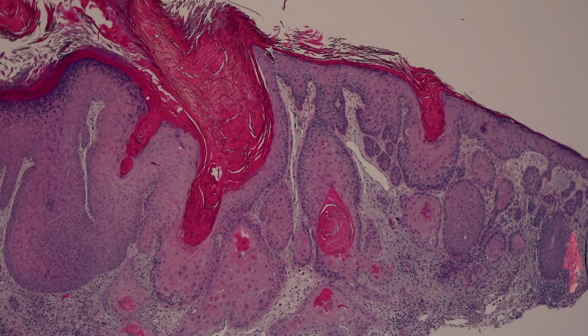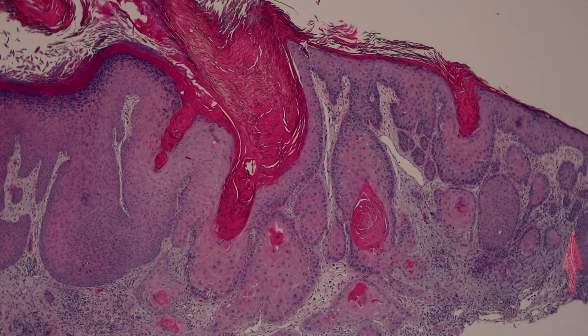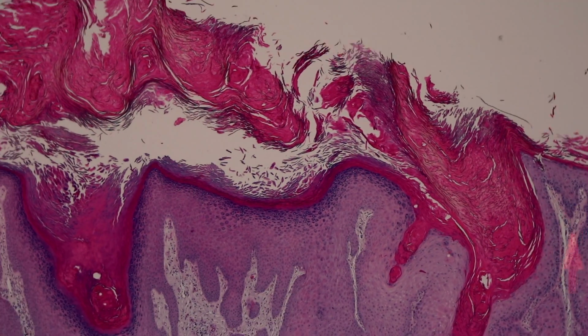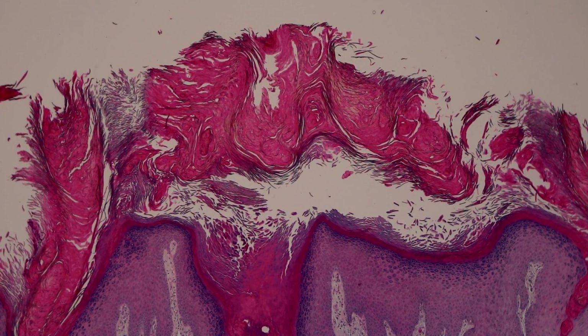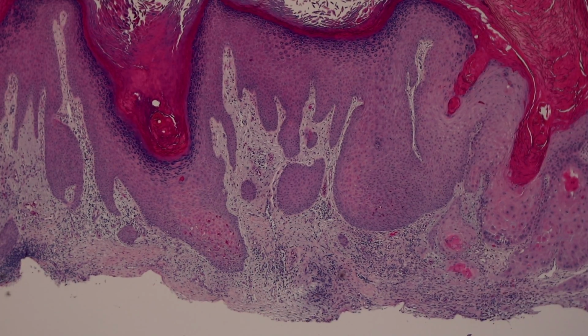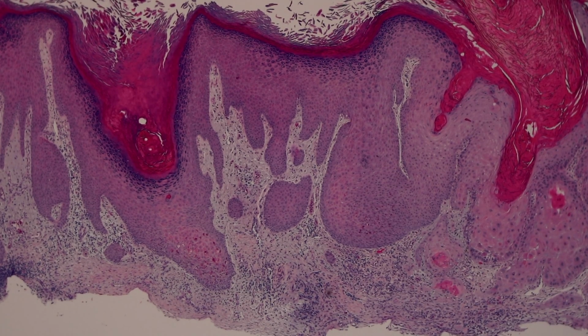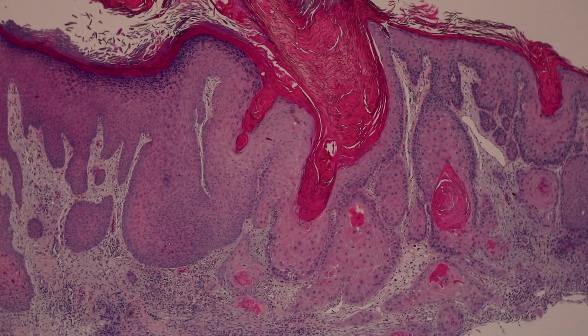I don't see any obvious malignancy here, but it's possible that down underneath we may not be seeing the entire lesion, because this often happens where this area looks like a good area to biopsy, and a derm may get what they think is a thick biopsy, but again, it may look thick because of the massive keratin over it and not actually be sampling much of the dermis. So the deeper a shave that you can get on a keratotic lesion, the more likely the dermatopathologist will be able to give a definitive diagnosis.